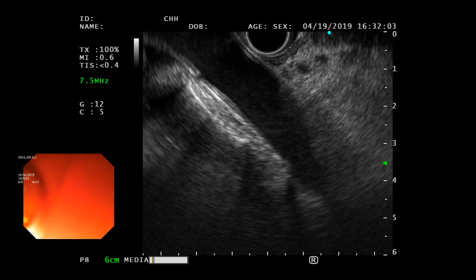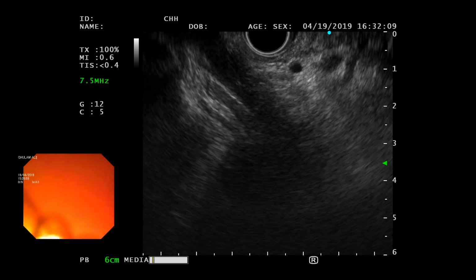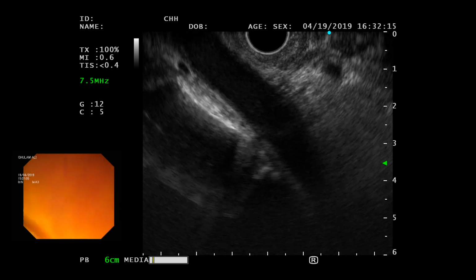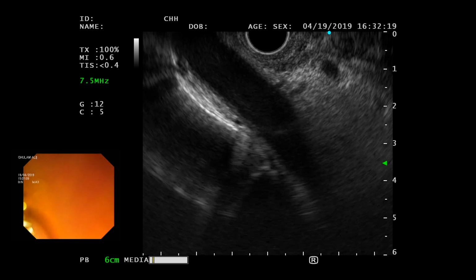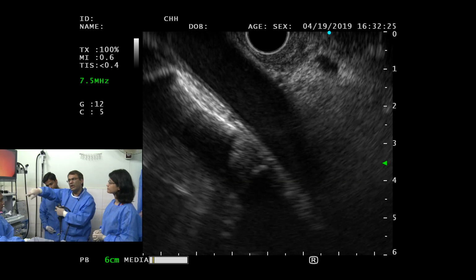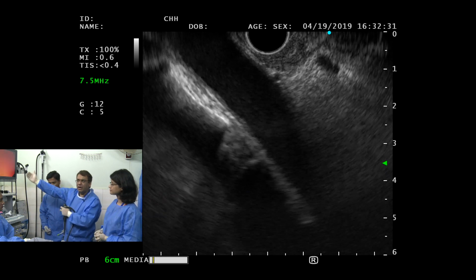Yeah, that would have been different. So this is a totally different case scenario. So every case, every scenario, you have to adjust accordingly. Okay. So here, it's a lot of swelling, lot of edema there. I think it's chronic pancreatitis or a mass compressing on the duodenum, leading to stenosis. I got through that, and now I'm in the second part of the duodenum.